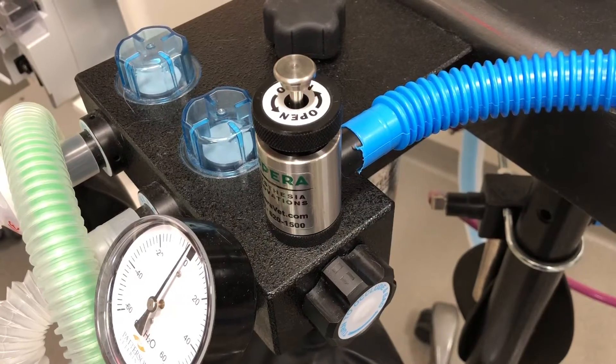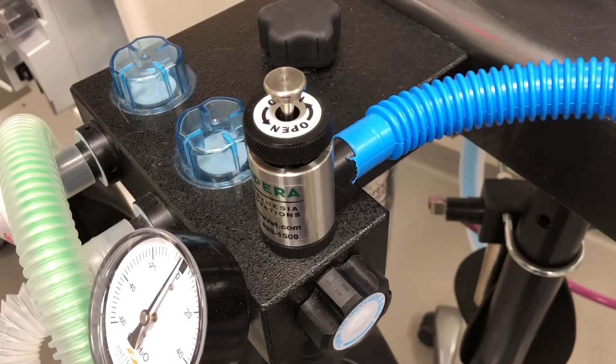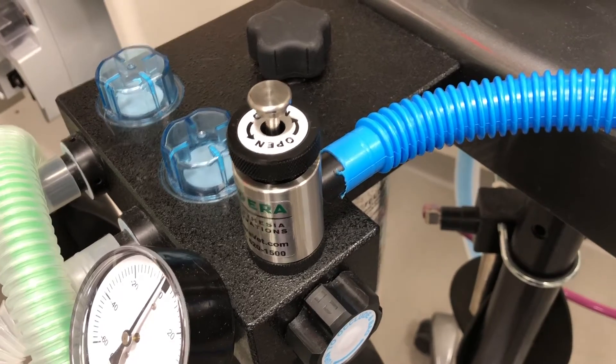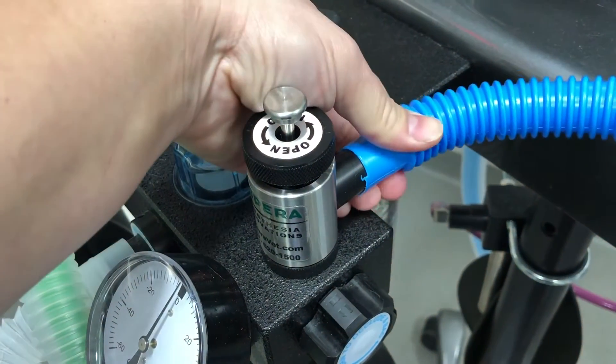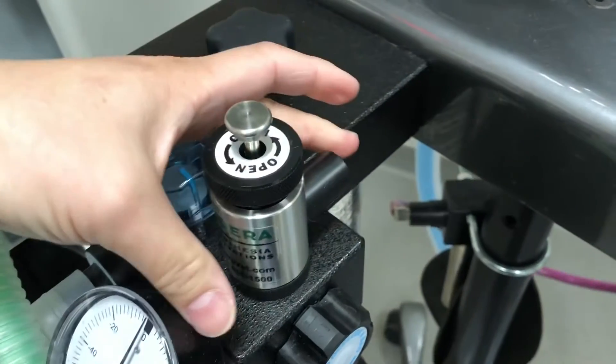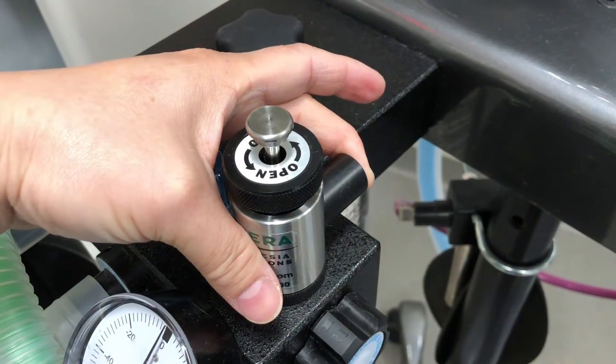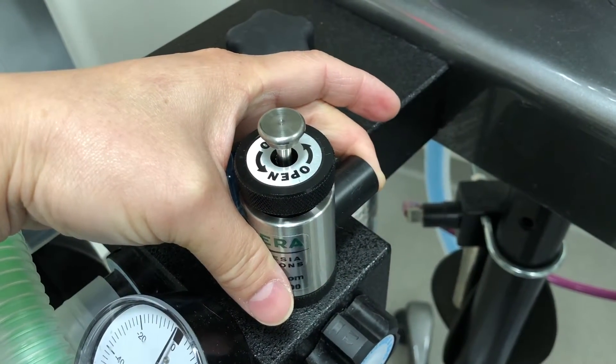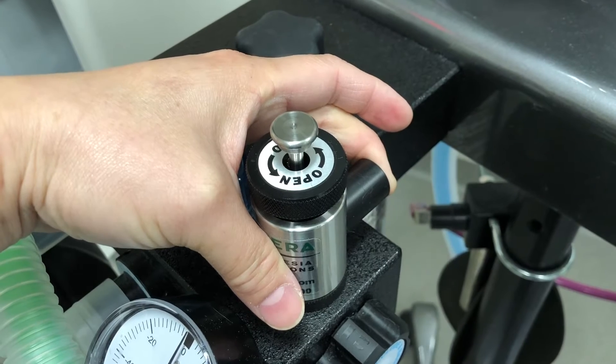Because of the safety mechanism of the Supira valve, it's going to require a new technique to pressure check your anesthesia machine. Remove the scavenge from the back and occlude the hole with your finger. Then you will be able to press the oxygen flush to pressure check your machine.